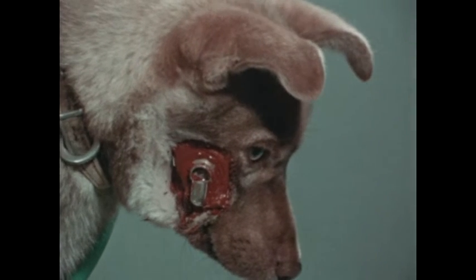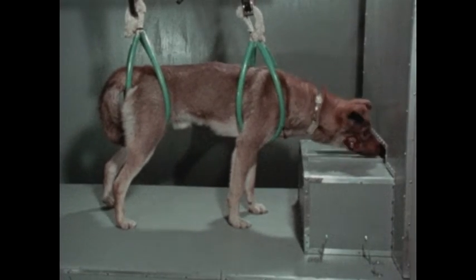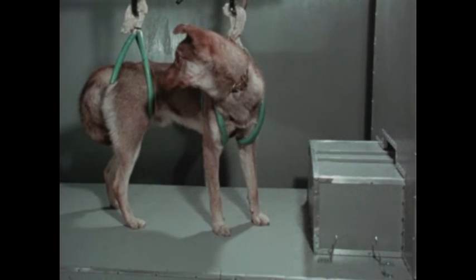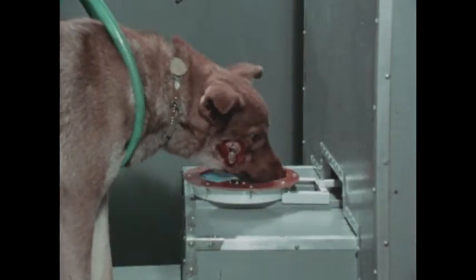Now we can start the experiment. We're using basically the same elements that Pavlov used. We know that the dog responds normally to food, and we can count the drops of saliva being produced.